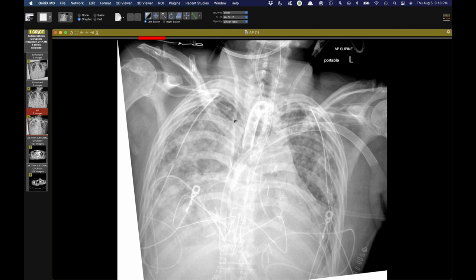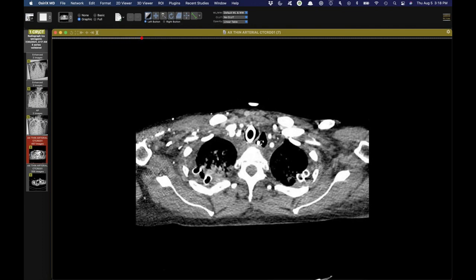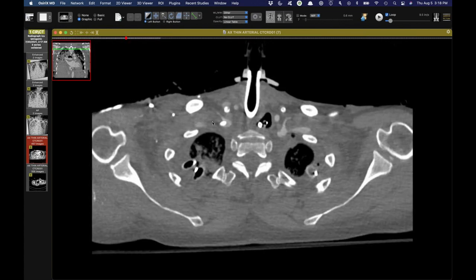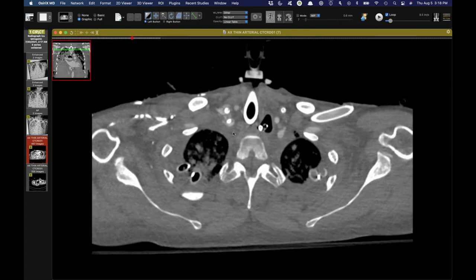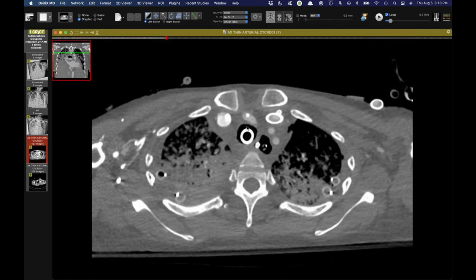It was recognized at the time based on, I think, the type of blood being returned and also the pulsation from it. So when this happens, or when you see this, obviously the first thing to do is not just to panic and yank out the catheter. And they didn't. They did a CT, and you will see this was the CT that was done, and the catheter going directly into the subclavian artery right here. And I looked at the note too. This was a blind stick, not done under ultrasound, according to their note.